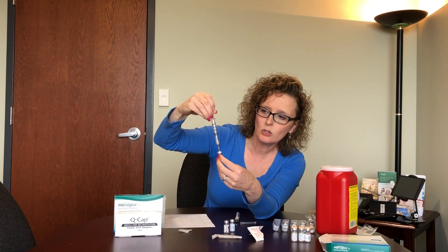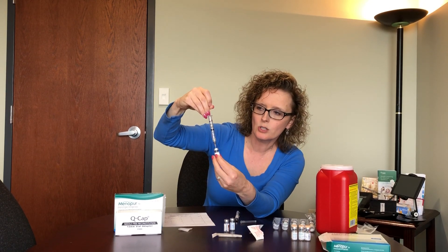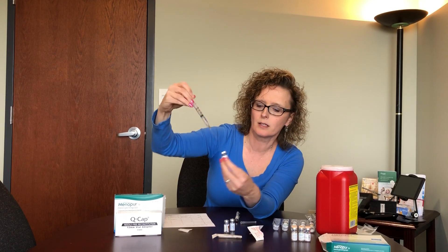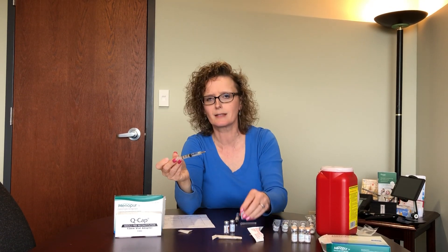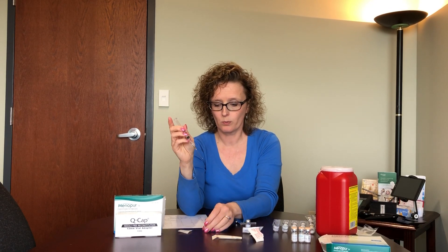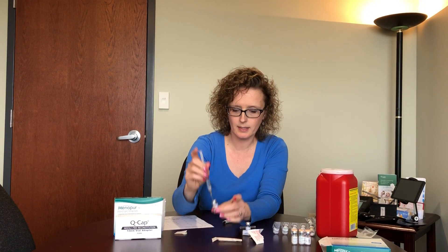Once you get the saline to the one-ml mark, stop and pull the vial off the bottom — you'll hear a nice pop because everything is kind of vacuum sealed. Next, we're going to take this saline and mix some Menopur. Pop the peach cap off the Menopur vial, take your alcohol swab and wipe it down, then put the saline into the vial.